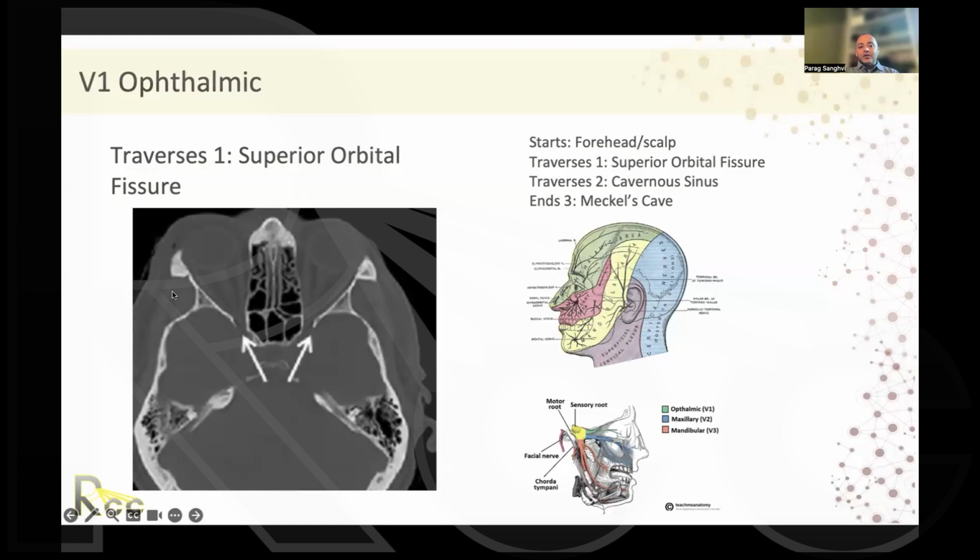So you're worried about the optic nerve, you're worried about the retina, you're worried about the globe itself, you're worried about the cornea, and you're worried about the lens. The lens, as you know, is the least of our issues. You can treat the tumor and tell the patients that they are going to get a cataract and they're going to need cataract surgery.